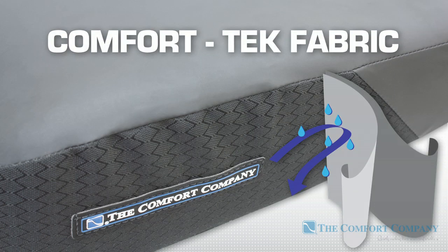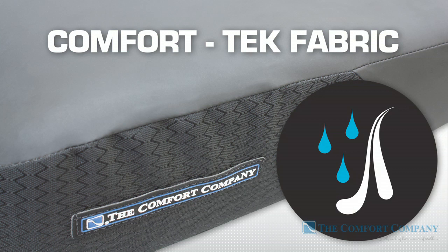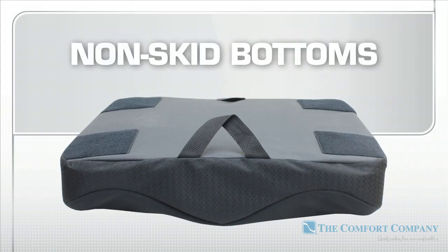Comfort Tech is a multi-dimensional stretch fabric that has supple, leather-like properties, providing an easy-to-clean surface and protection for the inner cushion. Both cover options feature hook and loop attachments and non-skid bottoms.